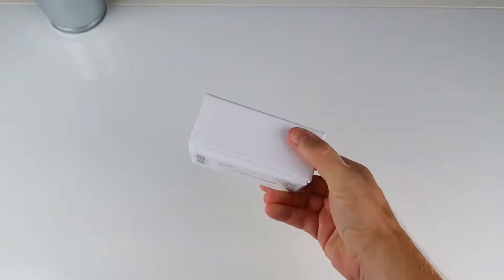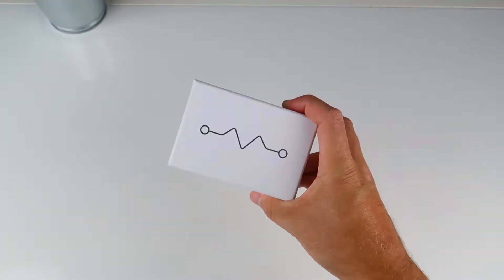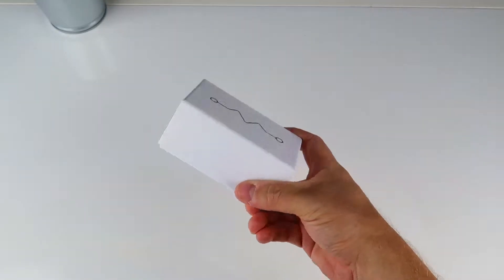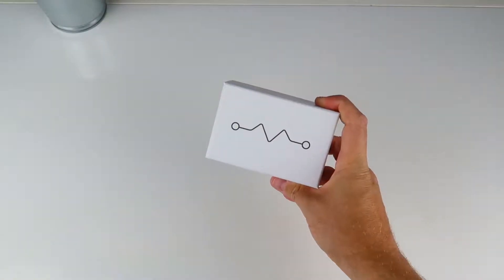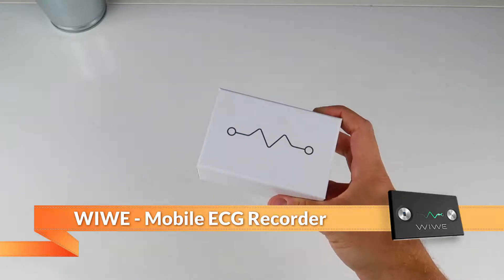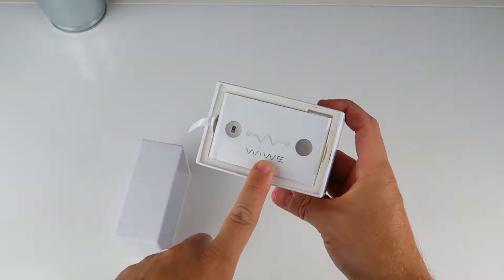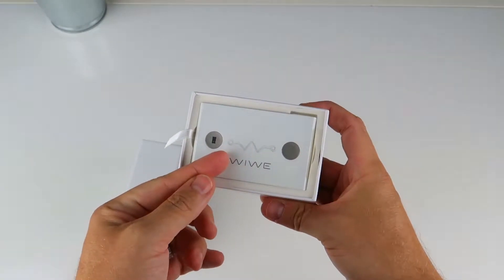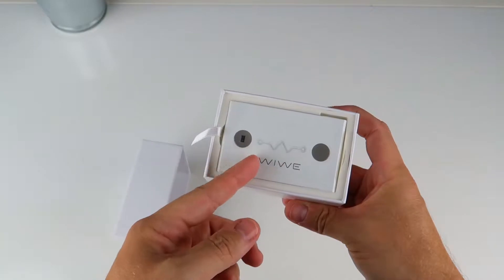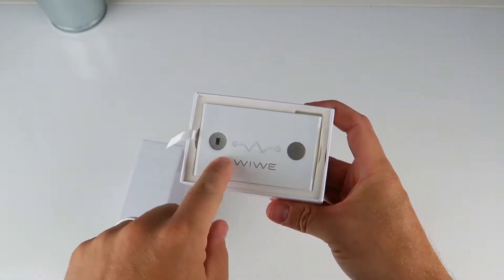We're hoping that this cool little device, which retails for around 289 euros, will help save people's lives. Considering that this device can help share information with your doctor for early warning signs of heart issues, and three out of four of those heart issues apparently can be prevented according to their promotional material, that's not too much to ask. So let's do a little bit of an unboxing and a first look.